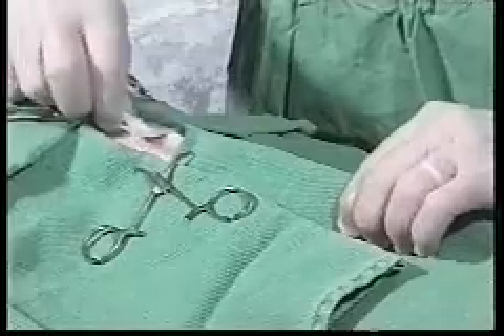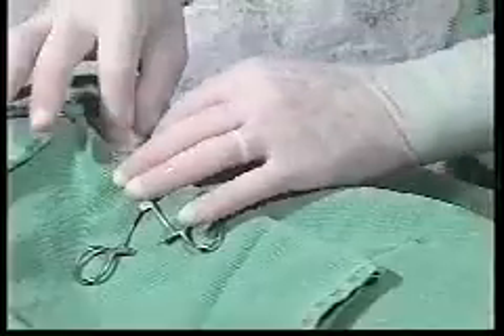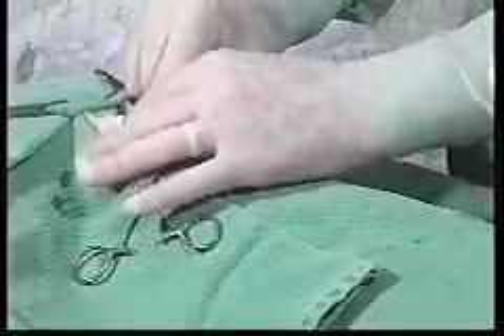A little bit here and then grabbing the tube — like so. We want to make sure that the tube is fully inserted. We are now going to suture the tube in place.